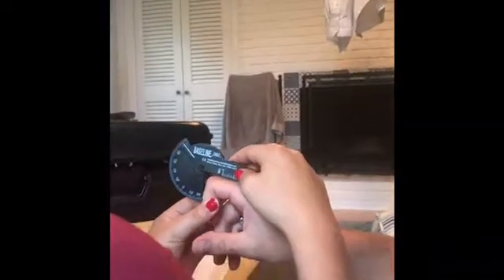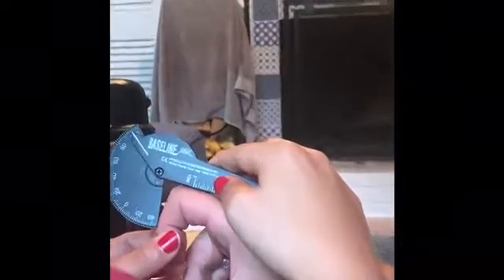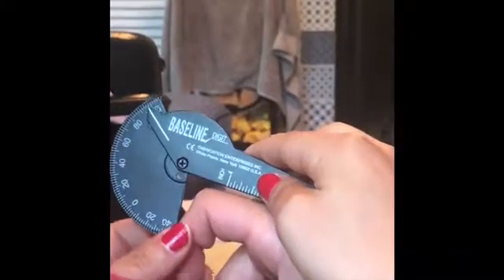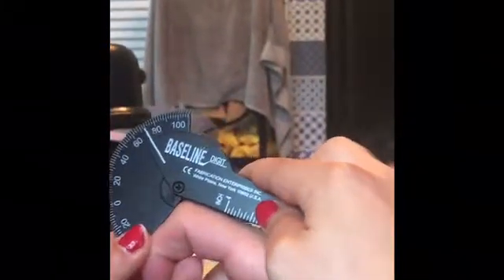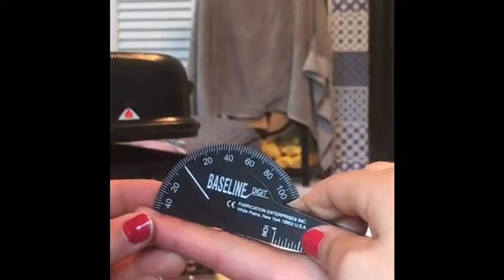We're going to be measuring the finger PIP joint extension. Typical range of motion is 100 to 0 degrees, so we're going to start at 100 here, and the axis is the dorsal surface of the PIP joint of the finger tested. Stable arm is the dorsal and midline of the proximal phalanx of the finger, and the moving arm is dorsal and midline of the middle phalanx of the finger. So start at 100, and it's at 0. Cut.